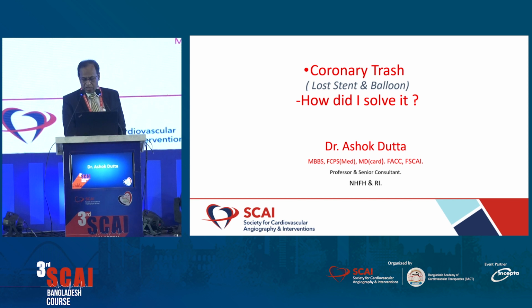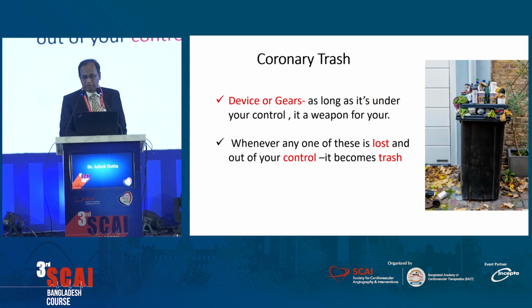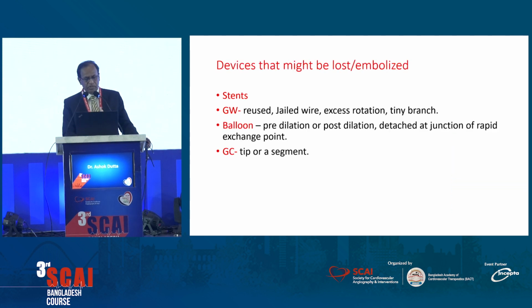My topic is coronary trash. I don't know why Ashok has chosen this talk for me, because after such beautiful talks, I have been asked to remove the garbage. Trash is garbage, that is, any device or gear. When it is under your control, it is a very powerful weapon for you. You can do a lot of things inside the coronary, but whenever you lose it, whatever the device is, it is trash for you. That device may be lost or stuck, either a balloon or even the guide catheter, especially the tip of the guide catheter.